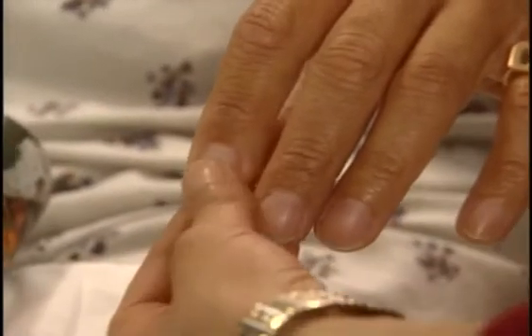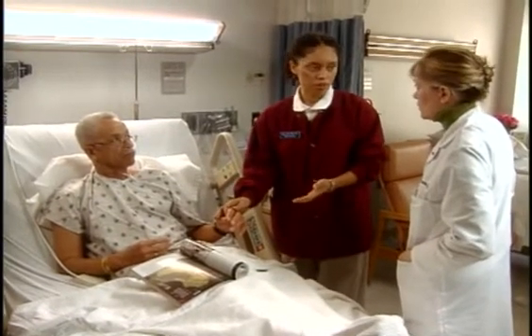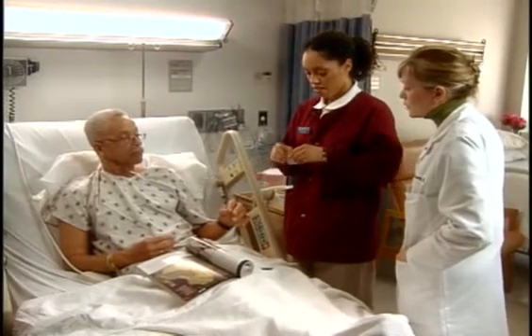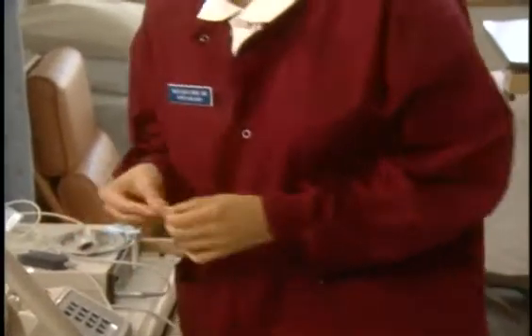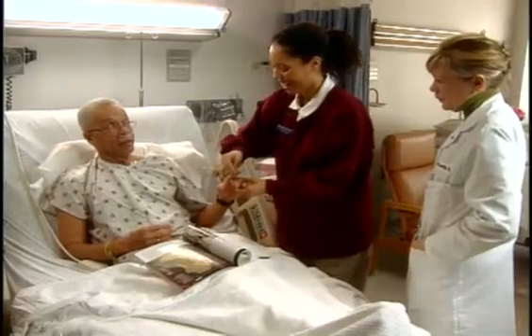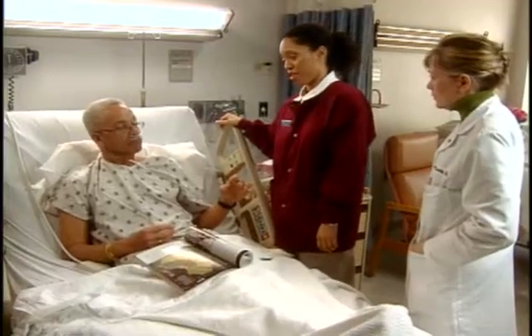What if the circulation is inadequate? Then I could use his earlobe or the bridge of his nose, providing I had the right sensor for the sites. Or you may use his toes, providing the circulation isn't compromised. All right. So now I'm going to cleanse the area with an alcohol wipe to prepare the site. And you don't have any nail polish on, so. Not today. But would that matter? Yeah, it could interfere with the measurement, and we want the results to be exact. And you don't happen to have artificial nails?